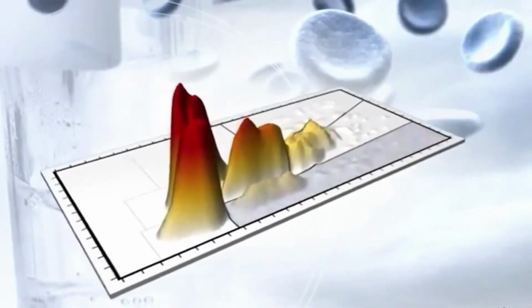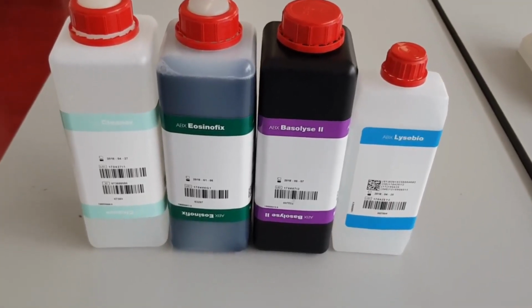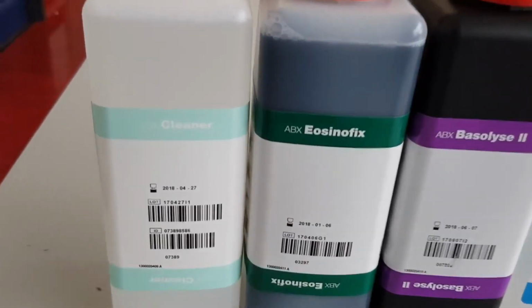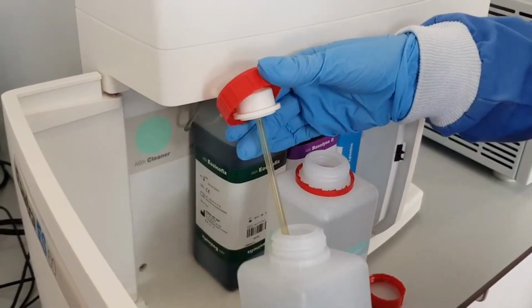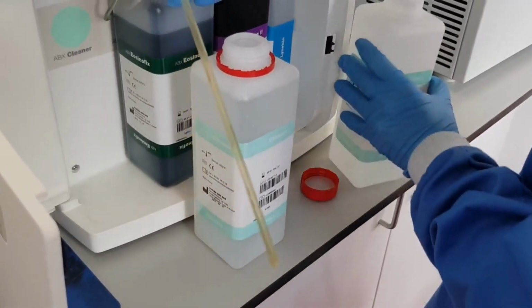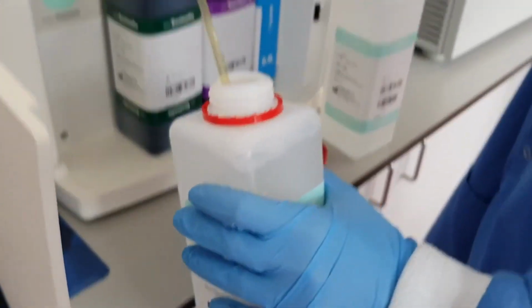The reagents used in hematology analyzers are cleaners, which are used to clean bath or chambers in the measuring unit. Diluent, which is normal saline used for the dilution of blood samples for the cell counts. Hemolysis reagents, used for in vitro quantitative detection of white blood cells in whole blood and hemoglobin concentration, etc.